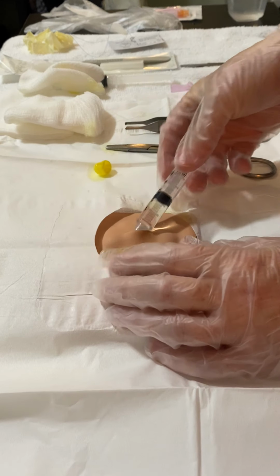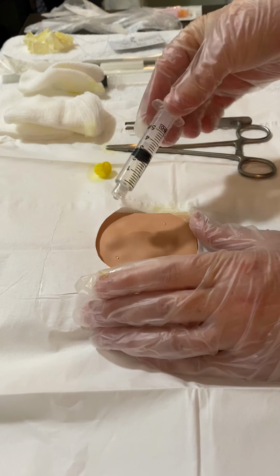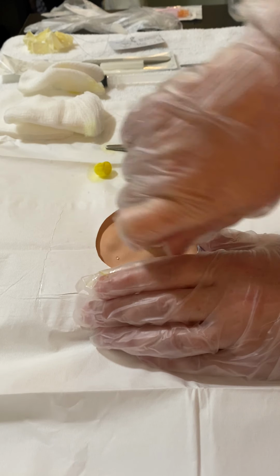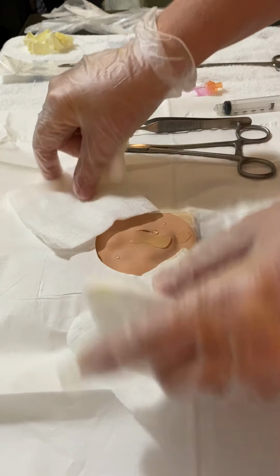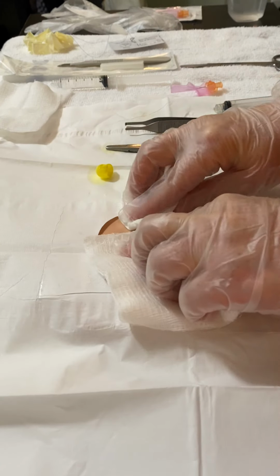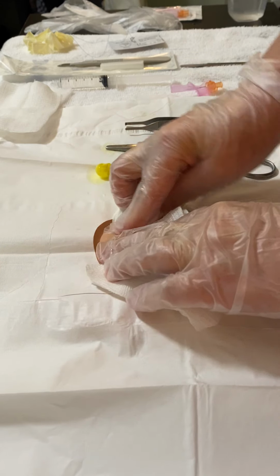So we could use some normal saline with an irrigant shield. We could just irrigate the area thoroughly. And then of course, make sure that we are expressing any of the rest of that fluid or material out of the area.